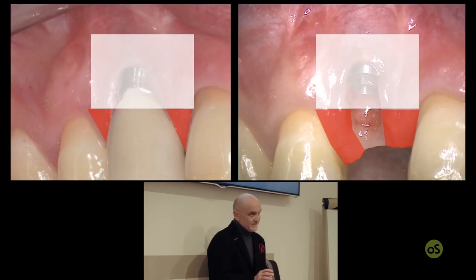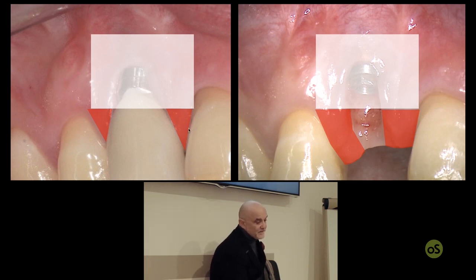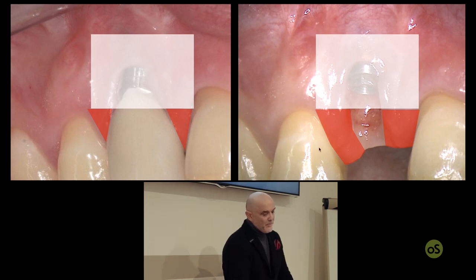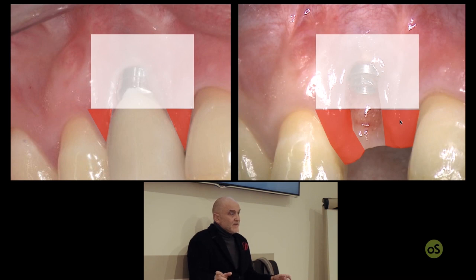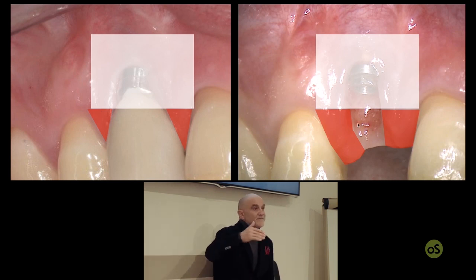How long does it take to change this papilla from this very, very small vascular bed? Almost nothing, very, very palatal compared to the surface that we have to cover. Very, very triangular, no isthmus, so only in the vertical dimension can it be desepithelialized, compared to this vascular bed, which is flat, but very wide, very, very thick in the buccolingual dimension. Blood supply here is 4 or 5 times bigger.